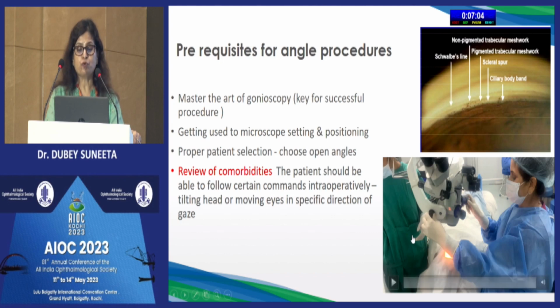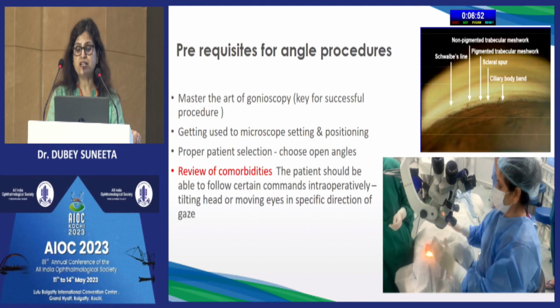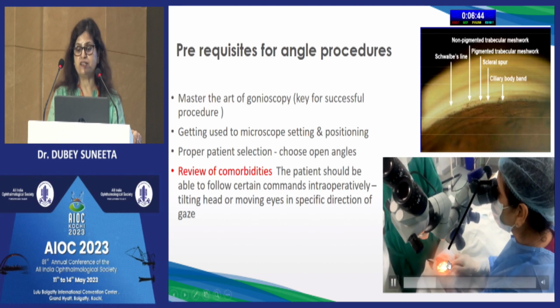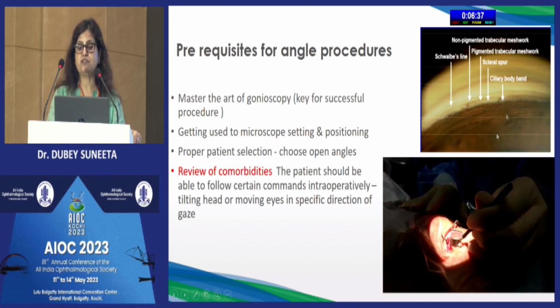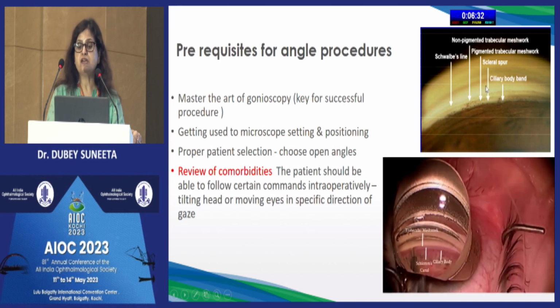We are used to coaxial illumination while operating cataract surgery or other intraocular surgery, but in MIGS, one has to get used to the microscope setting and positioning, wherein you have to tilt the microscope 30 degrees towards you and the patient's head away from you so as to have an angle of about 70 degrees. This is very, very important, and you need to choose open angles, especially during your learning curve, so as to have the en-face view of the angle wherein you see all the angle structures very clearly.